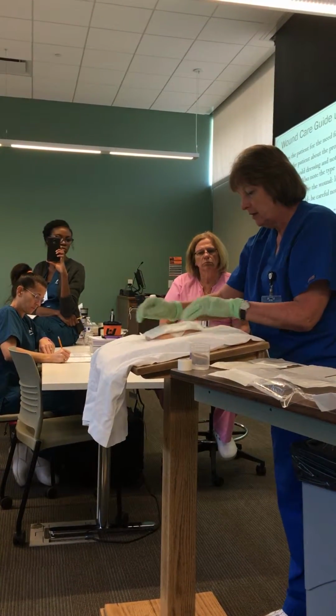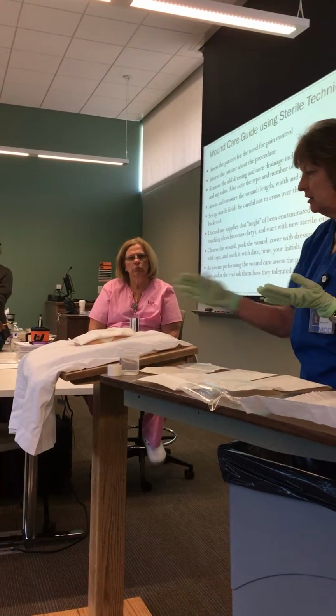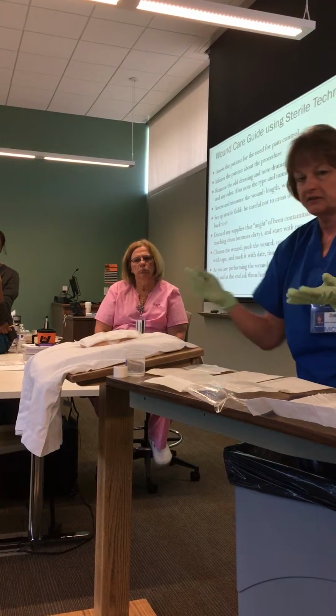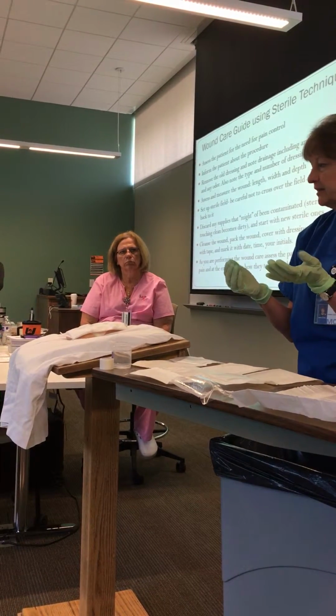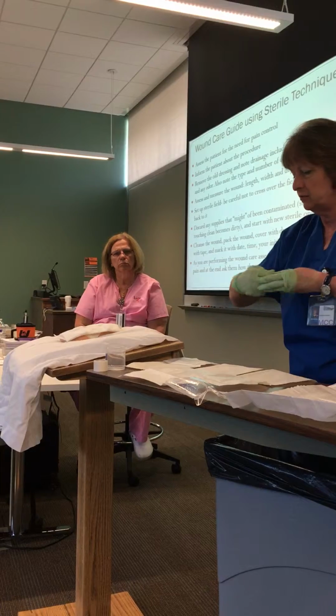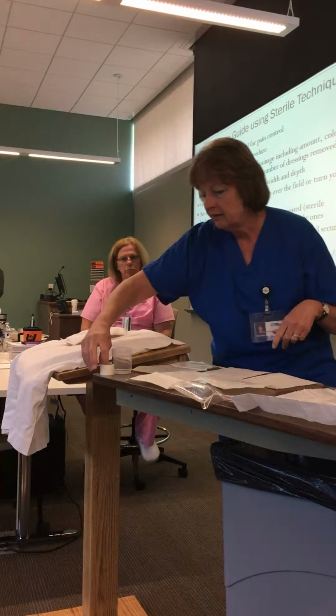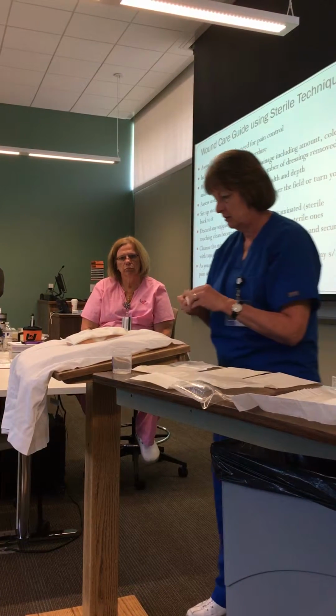All right, so now it's really hard to tape with gloves on. You've got everything covered, you're all set, so you can take your gloves off at this time unless there's a lot of oozing or you're afraid that you're going to be exposed to blood or body fluids. So go ahead and take your gloves off, and then now I need to tape.